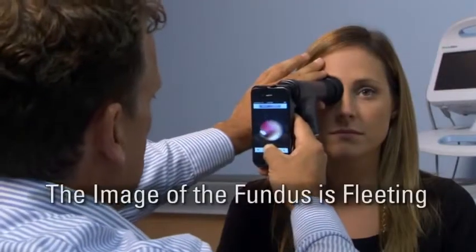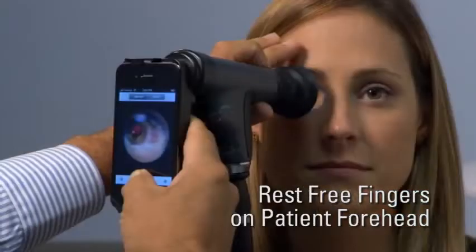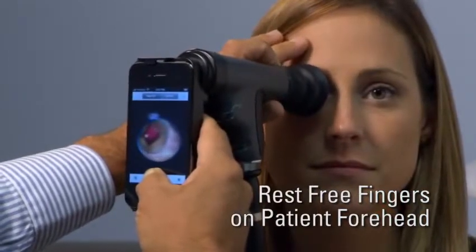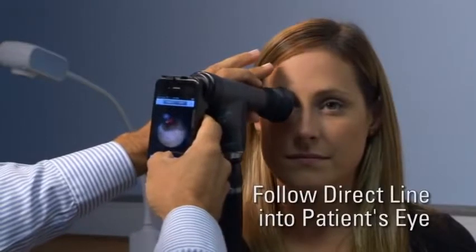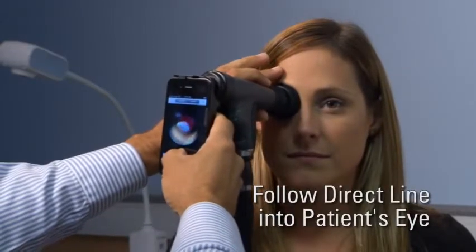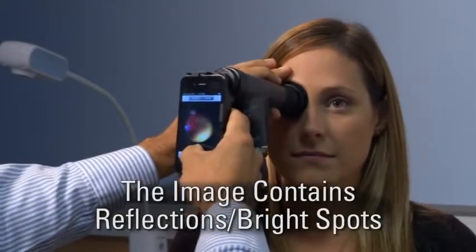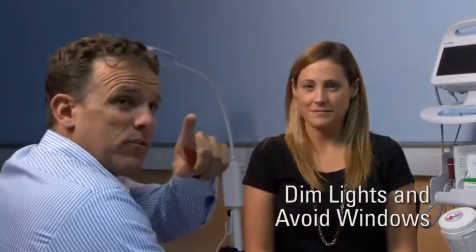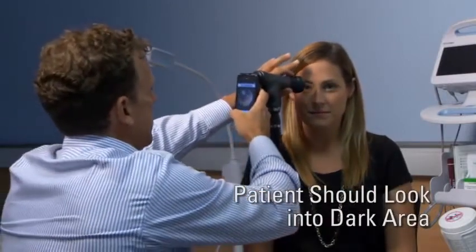If the image of the fundus is fleeting and you can't seem to hold it for more than a split second, practice holding the scope as steady as possible and rest your 3 free fingers on the forehead of the patient for stability. Make sure you follow a direct line into the patient's eye, maintaining the same plane, like a train on a track. If the image contains reflections or bright spots, dim the lights and avoid being near windows. Ideally, the patient should be looking into a darkened area.